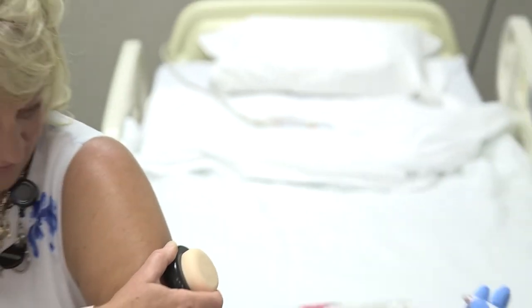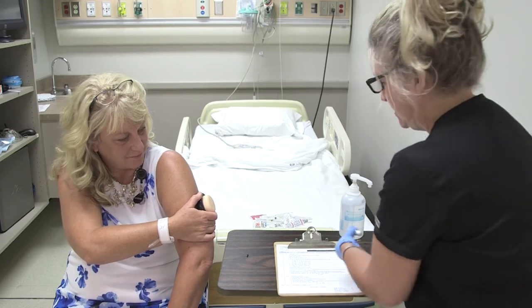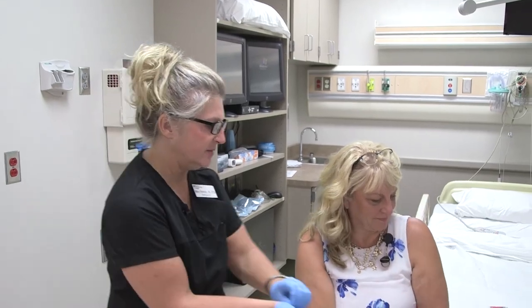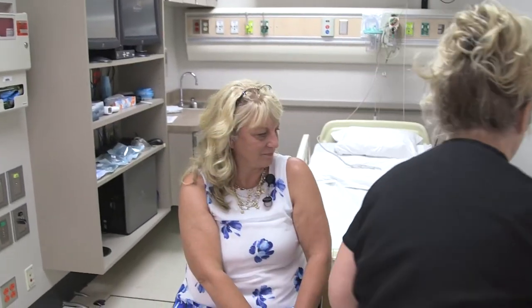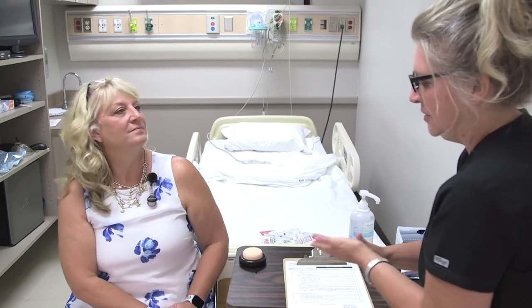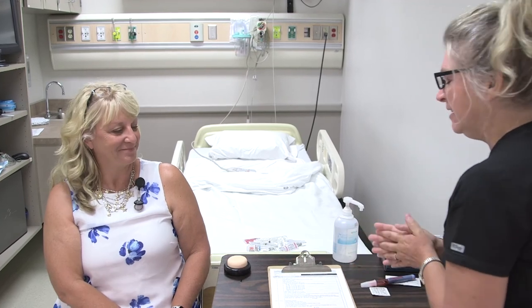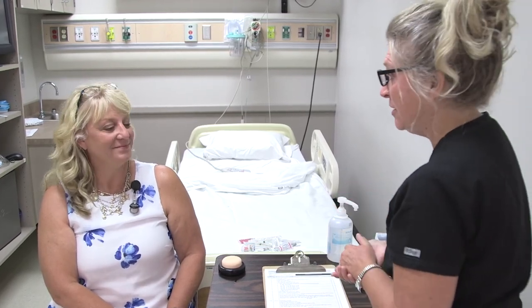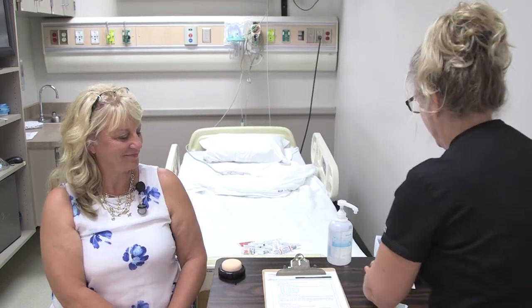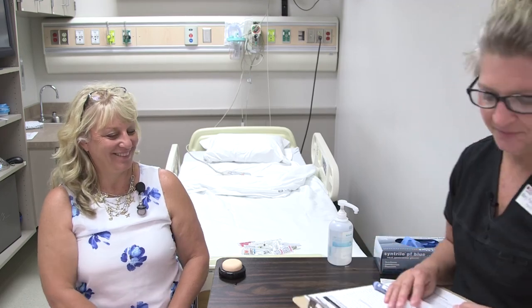This is a needle, so we need to dispose of it properly in the sharps container. Remove gloves, wash hands, and make sure to document the administration properly in the chart. If you need anything else or have any questions, I'll check back in about half an hour. Thank you for letting me give you your Lantis injection.